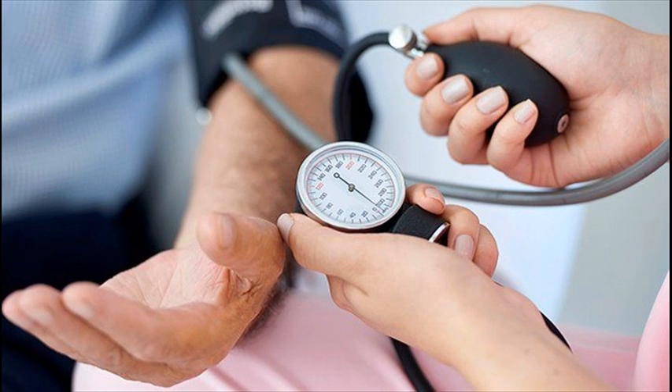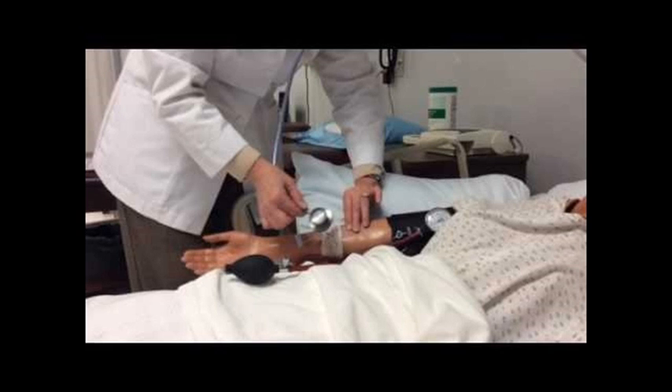Step 06: Determine a rough value for the systolic blood pressure. This can be done by palpating the brachial or radial pulse and inflating the cuff until the pulse can no longer be felt. The reading at this point should be noted and the cuff deflated.